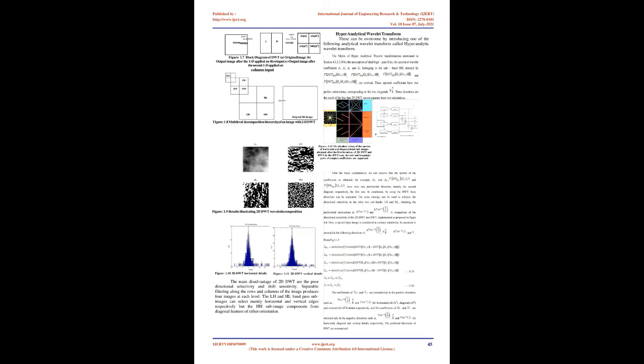The wavelet transformations are characterized by two features: the mother wavelet, MW, and primary resolution, PR, number of iterations. An appealing particularity of the 2D DWT is the interscale dependency of the wavelet coefficients. The main advantage of the implementation of 2D DWT is its flexibility, as it inherits from the Daubechies, Symlet, or Coiflet family.